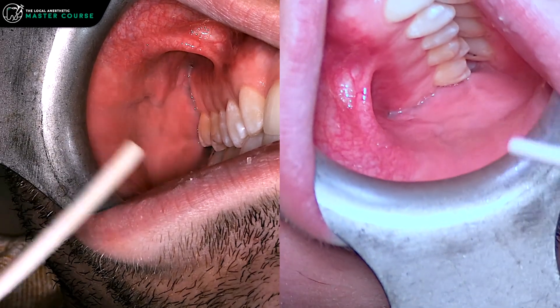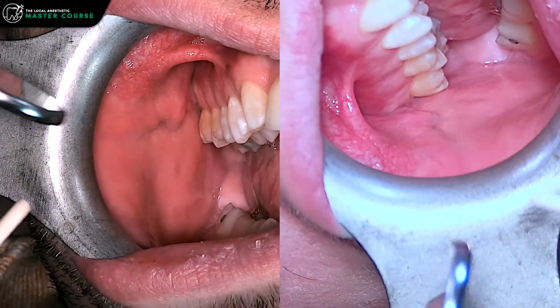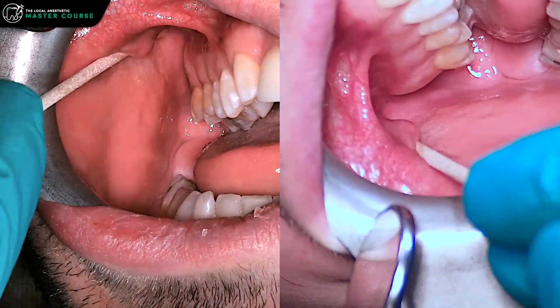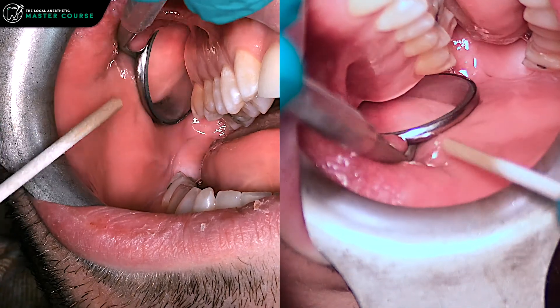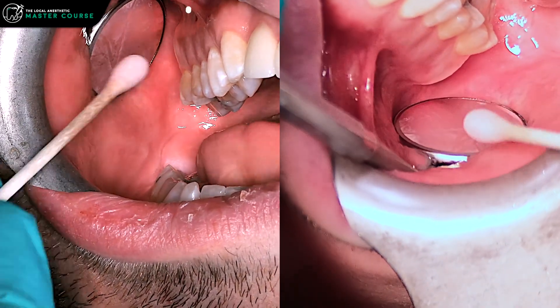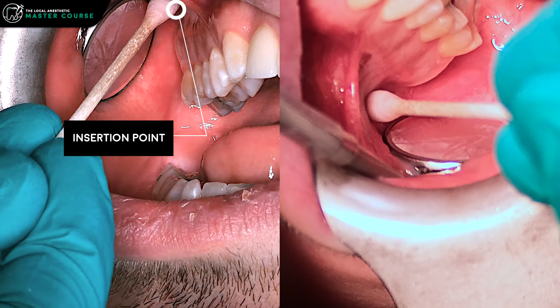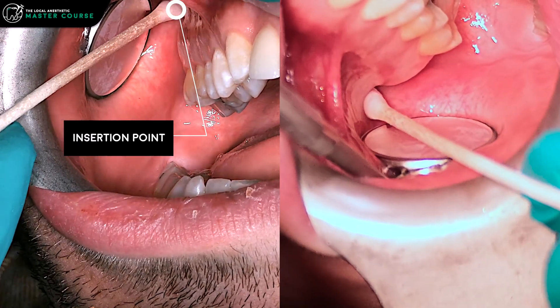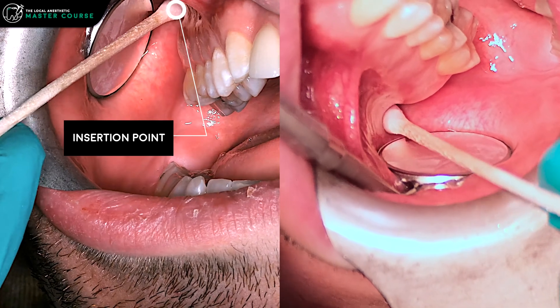The same principles apply — have the patient open a little bit, have them shift over with the lower jaw, and you can see how nicely that opens up back there. Put the mirror in kind of back behind, palpate with a cotton swab, feel for the zygoma, slide back until you kind of sink down — that's close to your entry point, so that's where you want to be.